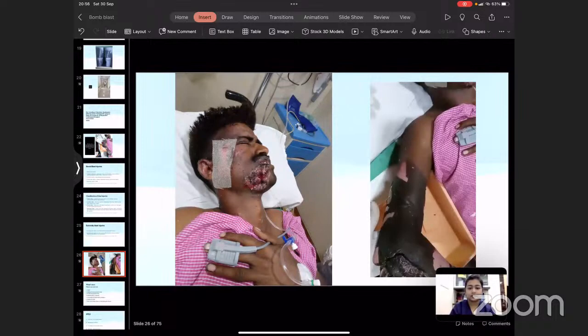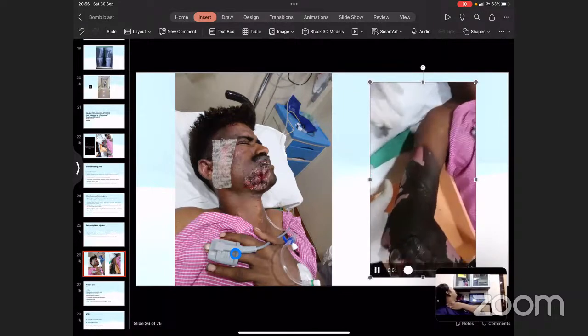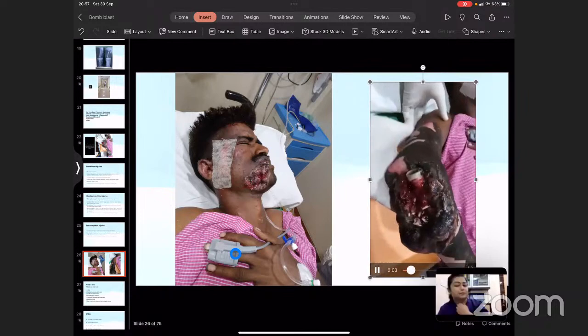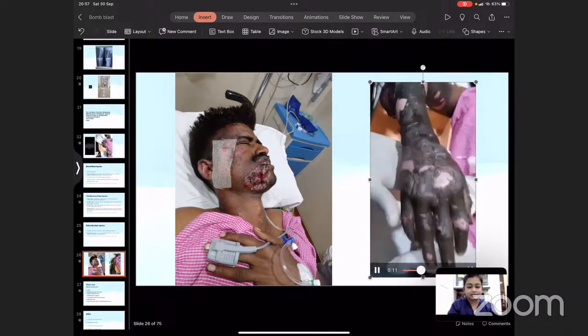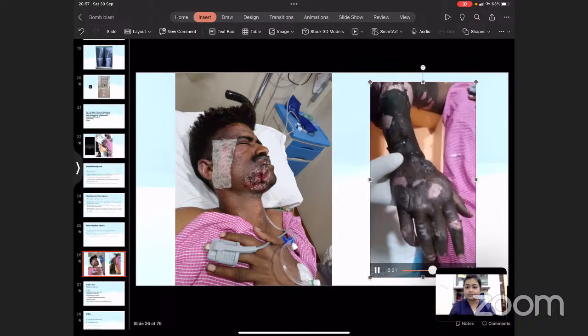Coming to this one, you can see this patient had a mandible fracture and also a zygomatic fracture. In this one, I'll play some videos. You can see the videos, very interesting. You can see that the radius has completely come out and the proximal ulna is almost shattered, and he could only move his fingers, and everything else is in big-time chaos.